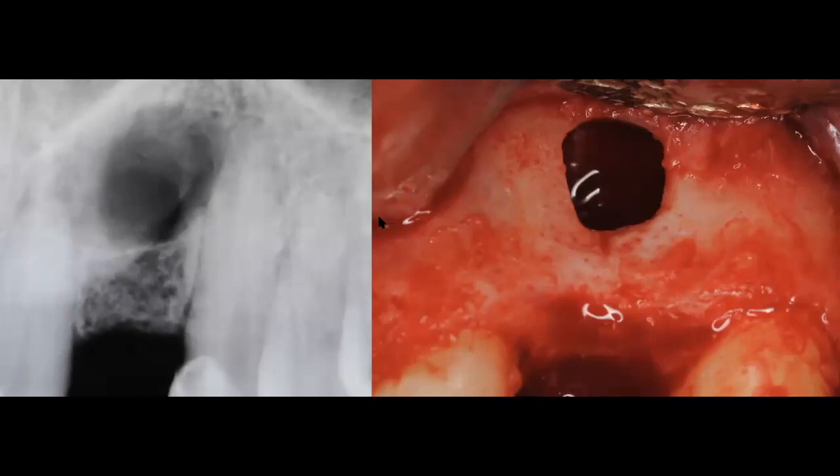So right there, we knew that our first option was not going to be to place an implant immediately after we access the site. So we were going to have a 2-stage or maybe even a 3-stage surgery. We were going to first graft, then place the implant in our second stage, and then have a third stage where we're going to go ahead and restore that implant.